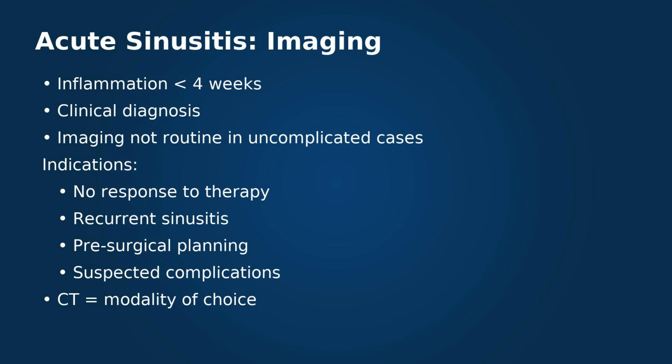Imaging is usually performed when there is lack of improvement after medical therapy in cases of recurrent sinusitis, for surgical planning, or when complications are suspected. In those settings, CT is the modality of choice because of its high spatial resolution and ability to evaluate both bone and soft tissue structures.